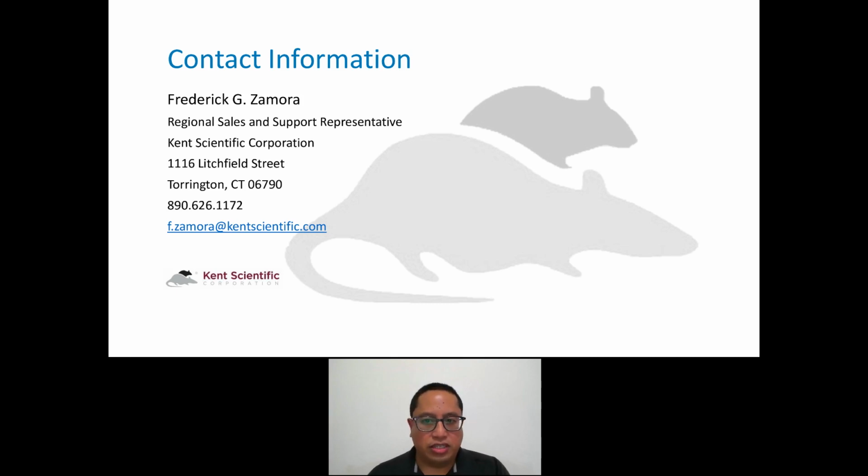If you do decide to use some sort of active scavenging, you will need to play around with your flow rate settings, because it's such low flow, that extra pulling from whatever is going on around the room or in the environment will affect the flow rate of your animals. So just keep that in mind.